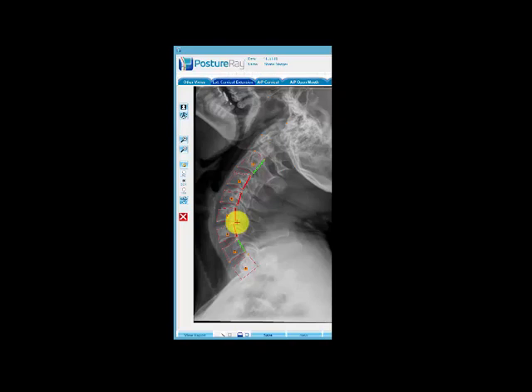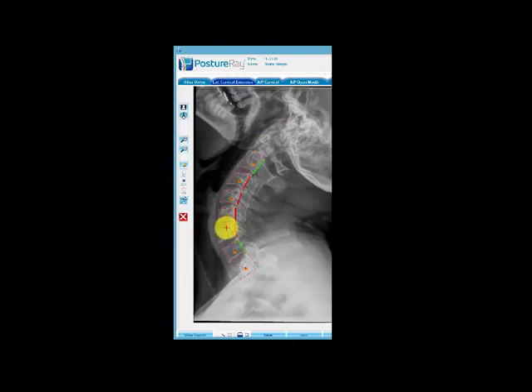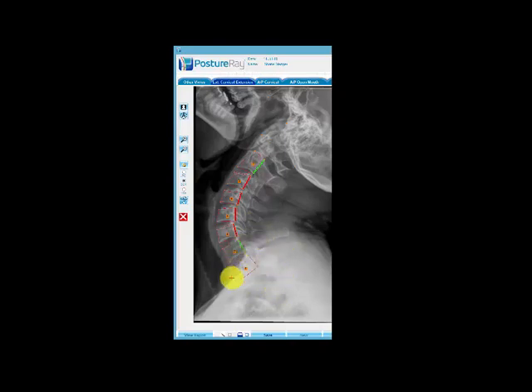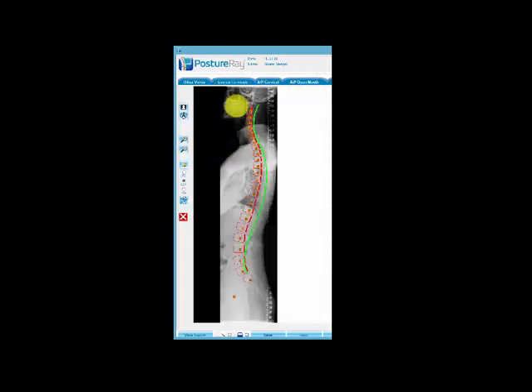The nerve roots that come out at C5-6 innervate the arms, so I knew I'd done some injury to that area. It doesn't bother me too much — I do get some discomfort in my neck from time to time and occasionally some pins and needles in my arms. This x-ray confirms my suspicion that there is an issue at C5-6. I would not want to get that joint adjusted because it's unstable. Instead, most of the work would focus on C7, T1, and T2 to improve extension and take pressure off C5-6.